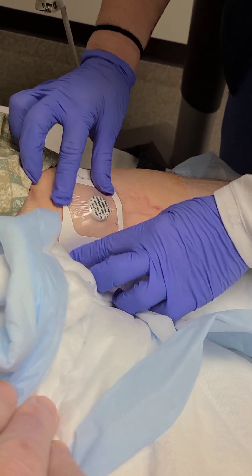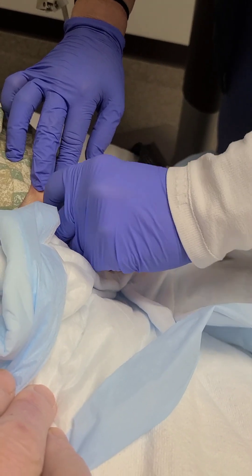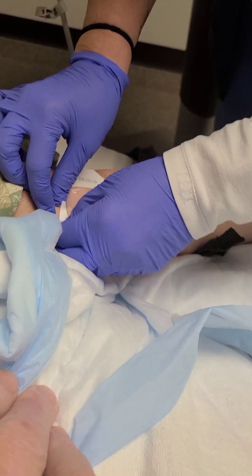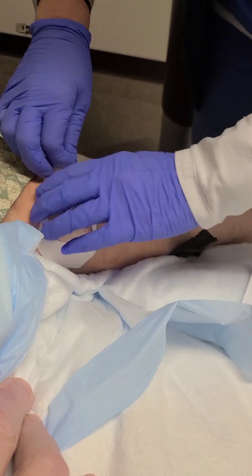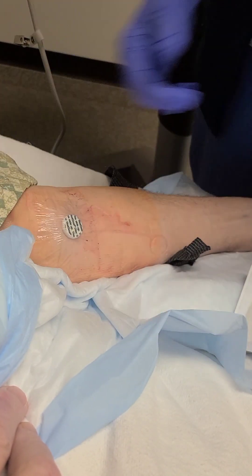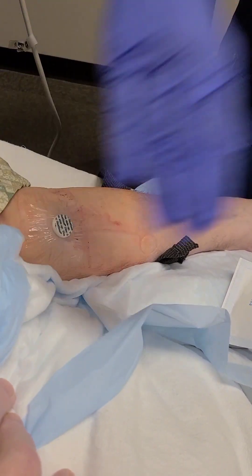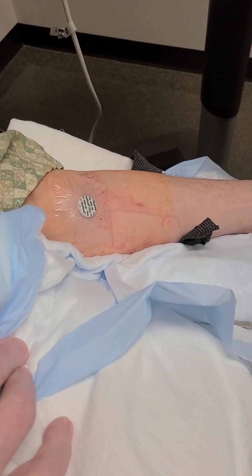And then how long do you leave that on for? Usually it's on for 24 hours, but I tell them to go ahead and leave it on until they get to dialysis — because usually it's in the morning the next day, or sometime the next day. And if it were to start bleeding, just direct pressure. And if it doesn't stop bleeding, then notify? Then I start calling the IR.